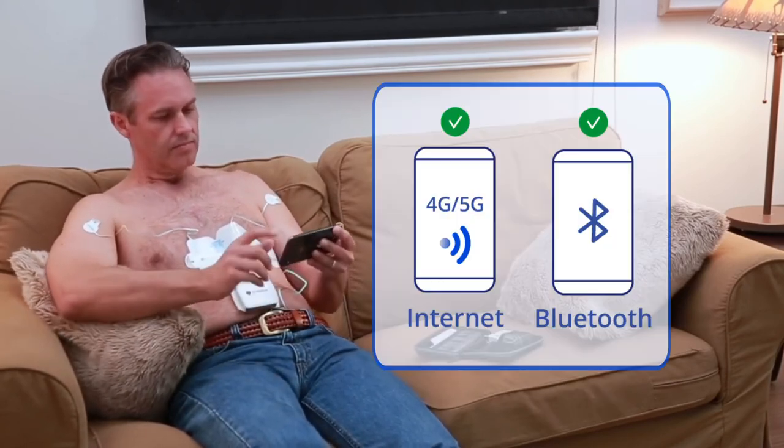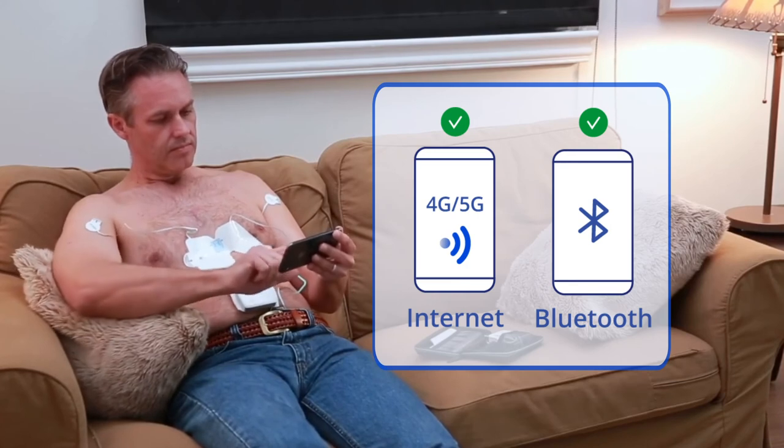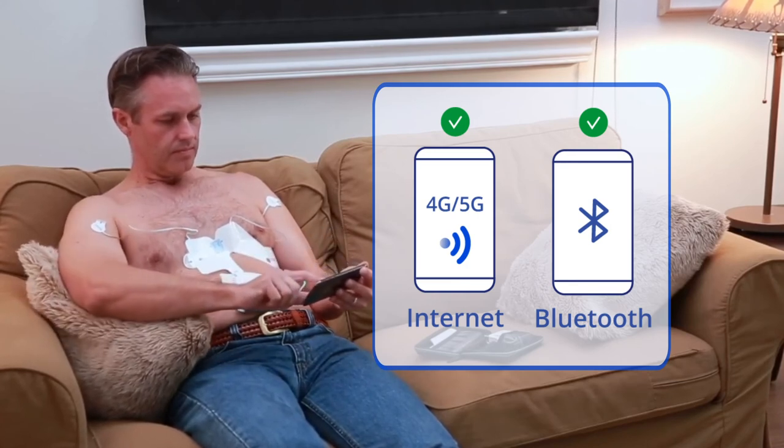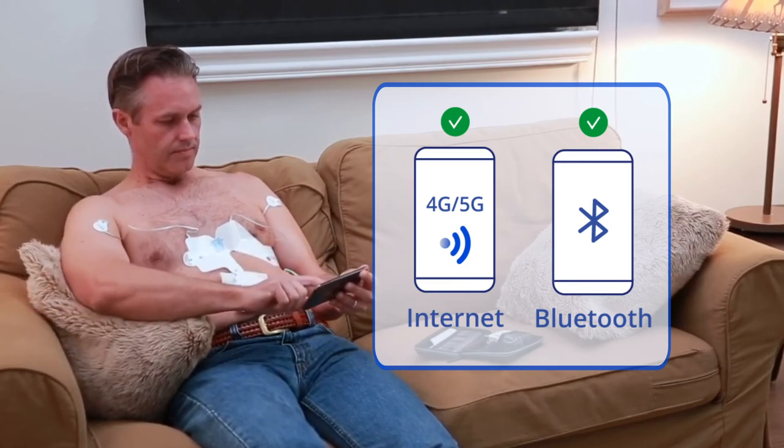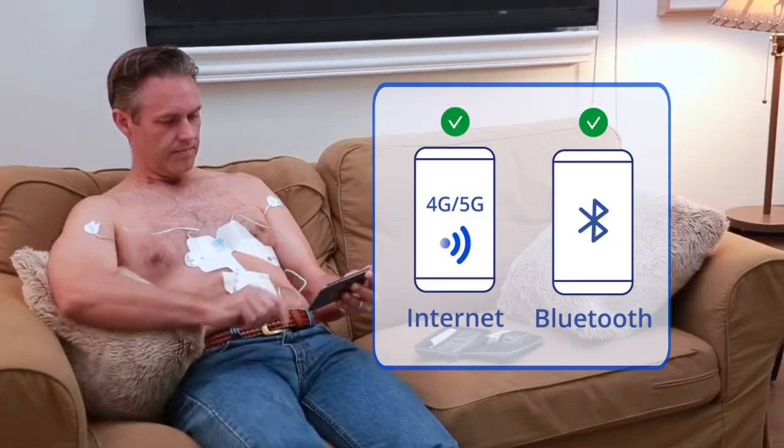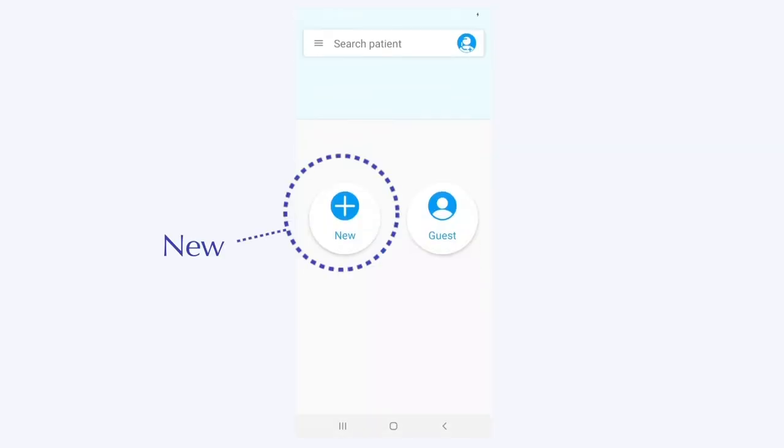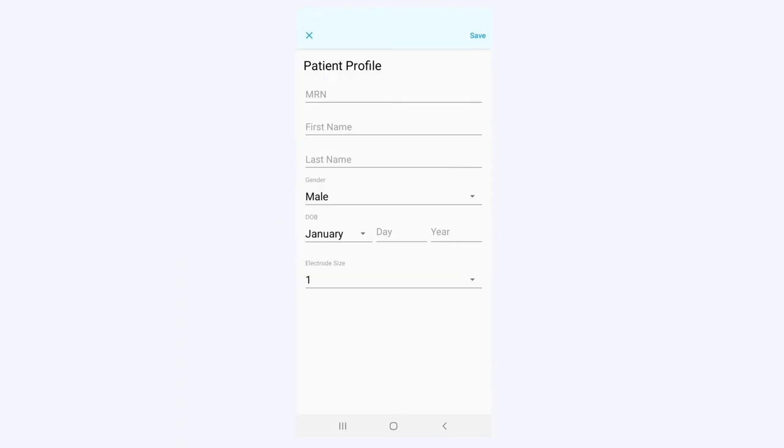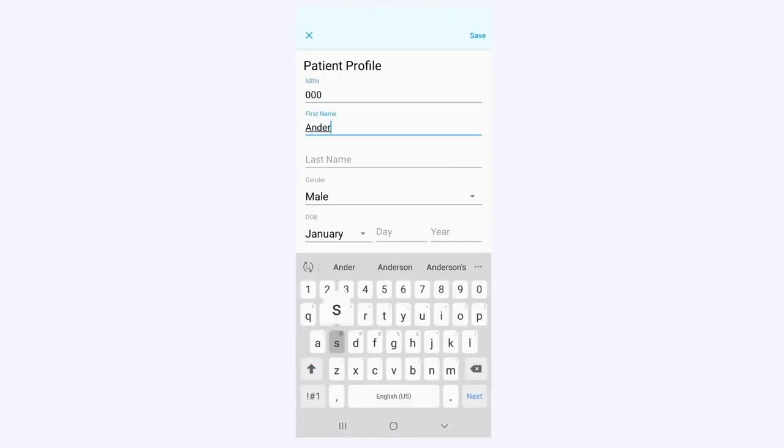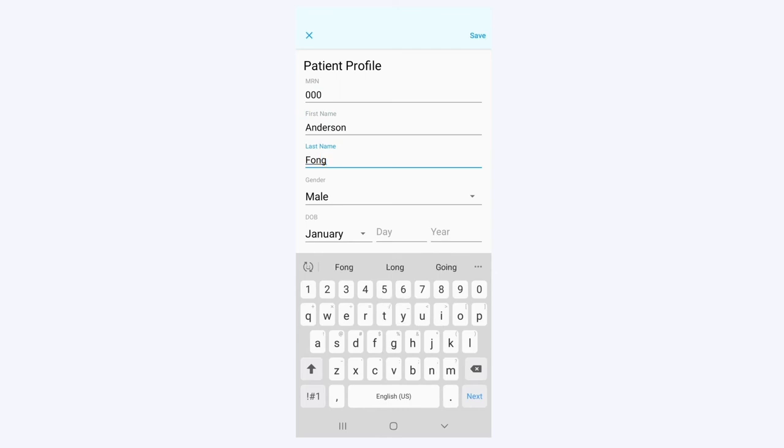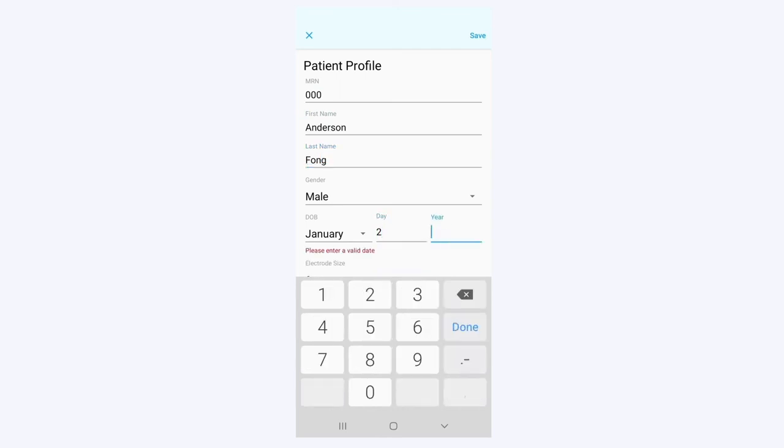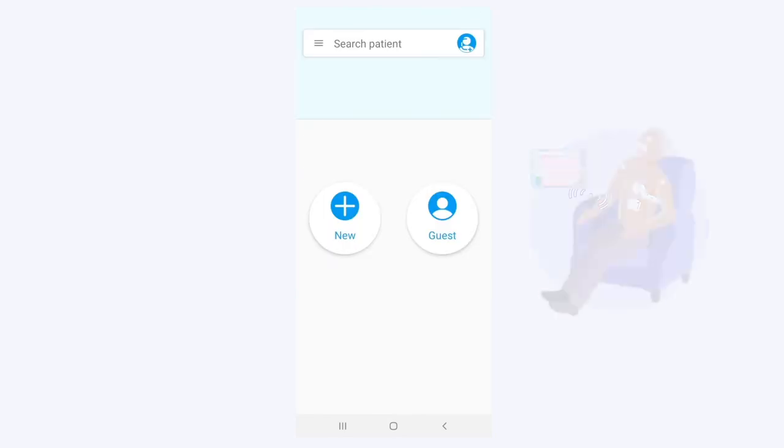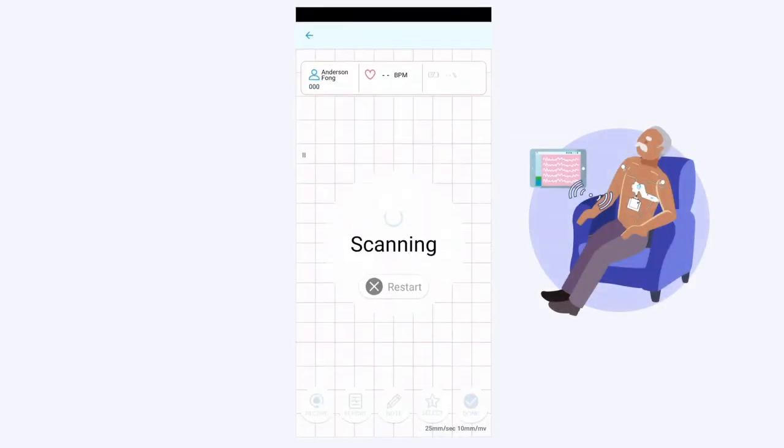Make sure your smartphone or tablet is connected to the internet and Bluetooth is enabled. Launch the app. Type in the username and password. Tap the left button 'new' and enter your information. If you do not know your medical record number or MRN, type 000. Tap save. Sit back and relax your muscles. The app will automatically connect to the recorder.